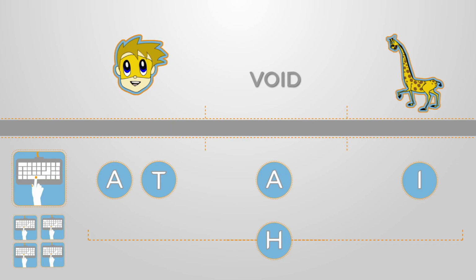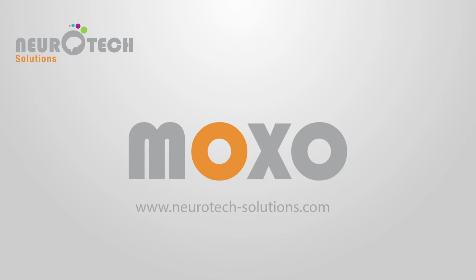hyperreactivity, more than a single keystroke in response to any kind of element. This video focused on the basic construction of the Moxo test and how the indices are measured.